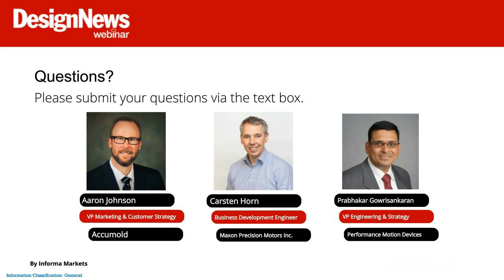The other example, which is not tied to miniaturization, is that, especially with COVID, there was a huge push for new ventilator designs. We worked with a few startups that wanted to get to market a lot quicker. They were able to take these development kits and prototype their whole setup, and then in parallel create their own card. Obviously cost becomes a priority there. So we've also worked with them on new advanced control techniques for stepper motors, which are cheaper, using closed-loop steppers with an encoder. There are a lot of techniques to balance your different axes, right? You have the power, the weight, and the cost. So it's about trying to get to the sweet spot.